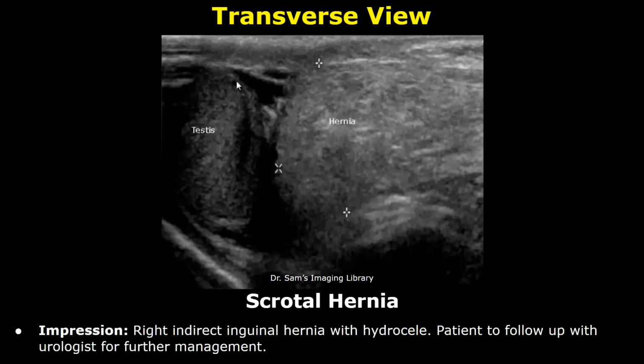In the impression you can write right indirect inguinal hernia with hydrocele. Patient to follow up with urologist for further management.